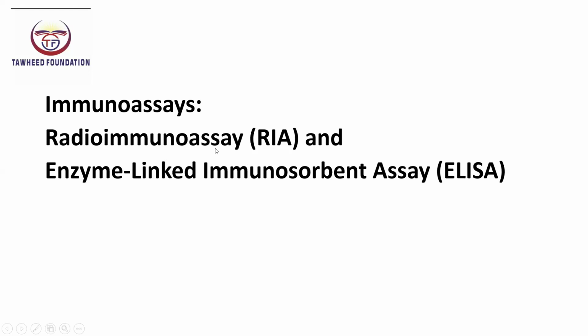It was introduced in 1960 by Solomon Berson and Rosalyn Yalow, whose pioneering work on insulin measurement in human plasma earned Rosalyn Yalow the Nobel Prize in Physiology or Medicine in 1977. So, RIA is based on a competitive binding principle where a radioactively labeled antigen competes with an unlabeled antigen from the test sample for a limited number of antibody binding sites.